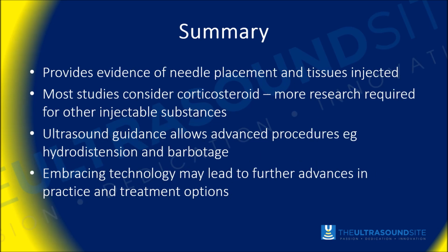It provides evidence of the needle placement and the tissues that were injected, and this can be important for a whole manner of reasons. As we mentioned, it can be evidence to support in a case of damages claim, for example, but also to just reassure the patient that the treatment was carried out in the expected way.